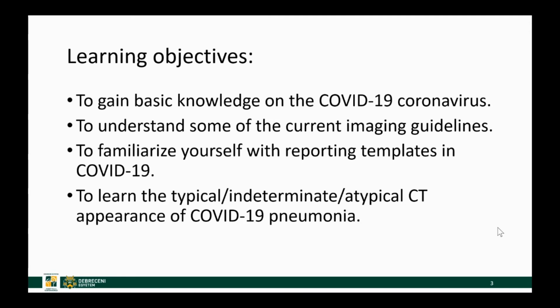And here are the learning objectives. So I would like you to gain some basic knowledge on the COVID-19 coronavirus. I would like to help you understand some of the current imaging guidelines and to help you familiarize yourselves with reporting templates in COVID-19 pneumonia. And the backbone of the presentation will be learning the typical, indeterminate, and atypical CT appearance of COVID-19 pneumonia.